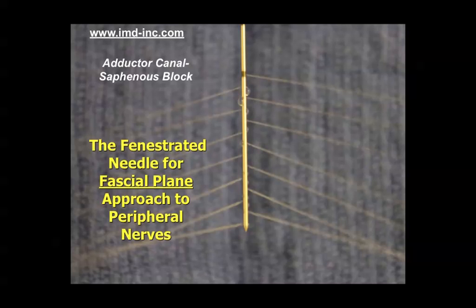We'd like to provide you with a brief instructional video on the use of a new fenestrated needle for fascial plane approach to peripheral nerves. In this particular talk, we are going to discuss the anatomy of the adductor canal and the saphenous nerve.